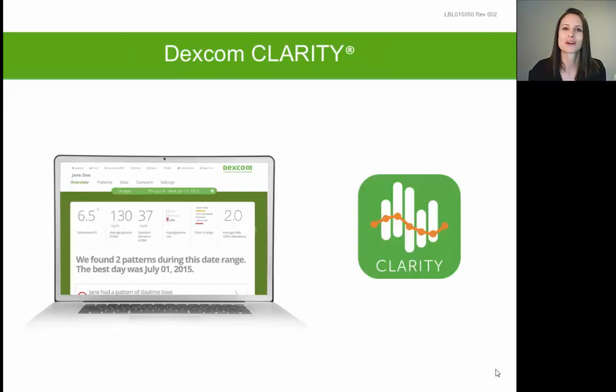One last piece of information pertains to Dexcom Clarity. Clarity is the reporting software that you and your physician can use to retrospectively review all of the Dexcom data collected over time. Clarity helps you and your physician focus on the detection of glucose trends and patterns so that more targeted and effective adjustments can be made to your treatment regimen. Your receiver displays the most recent 24 hours of glucose information but saves and stores the most recent 30 days. To upload that stored information into Clarity, go to clarity.dexcom.com, attach your receiver via the USB charging cable, upload your information, and review your Clarity reports.